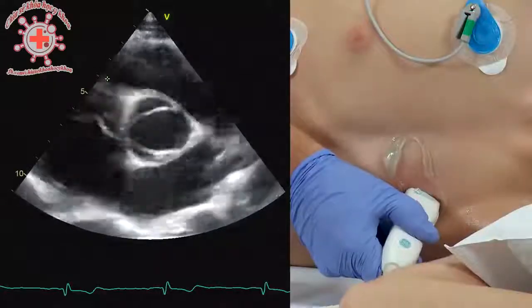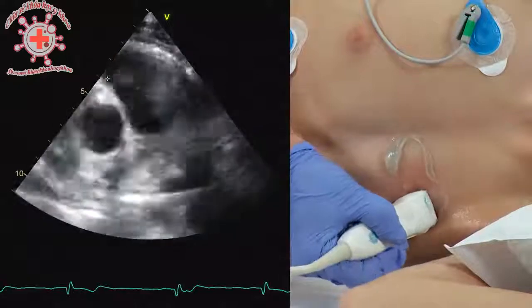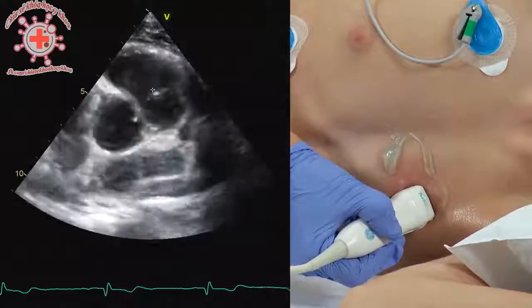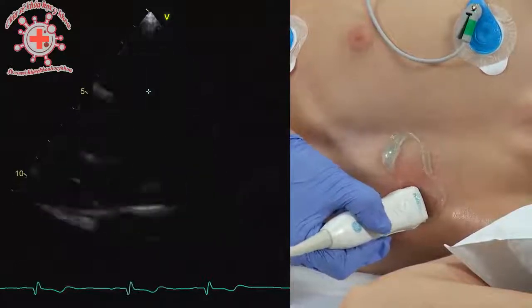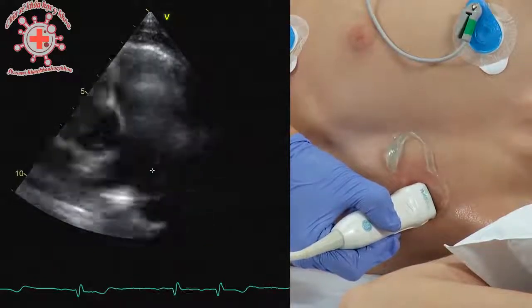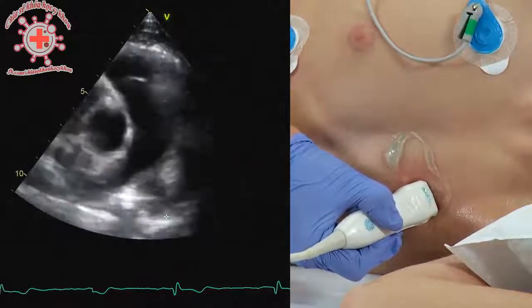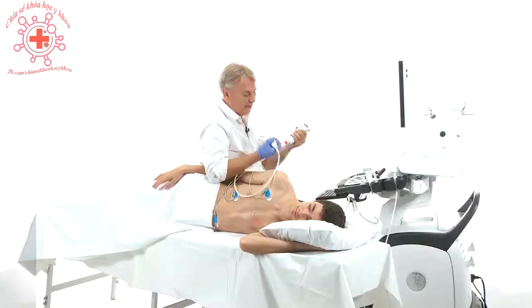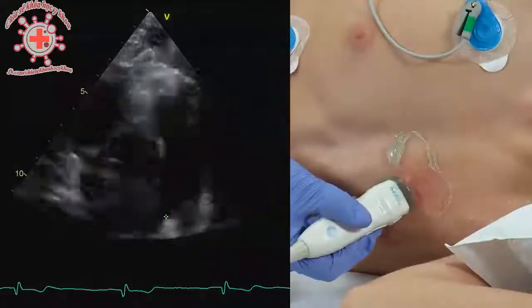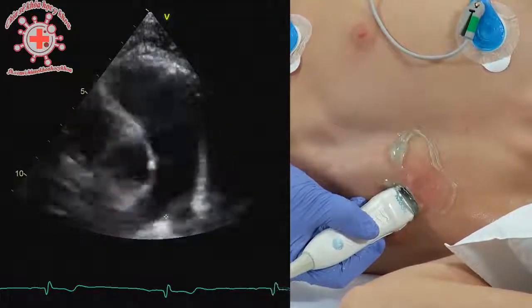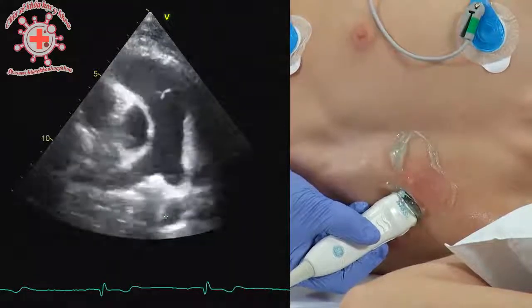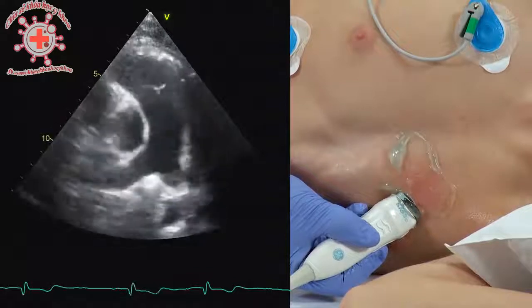Here is the tricuspid valve, this is the right ventricular outflow tract. Now moving towards the left shoulder and tilting the transducer a little bit more, we'll get to the pulmonic artery and the pulmonic valve — so this is the pulmonic artery. With its branches, the right and the left. Sometimes it actually makes sense to move the transducer a little further down, one intercostal space more caudal, and you'll get an even better view of the pulmonic artery.